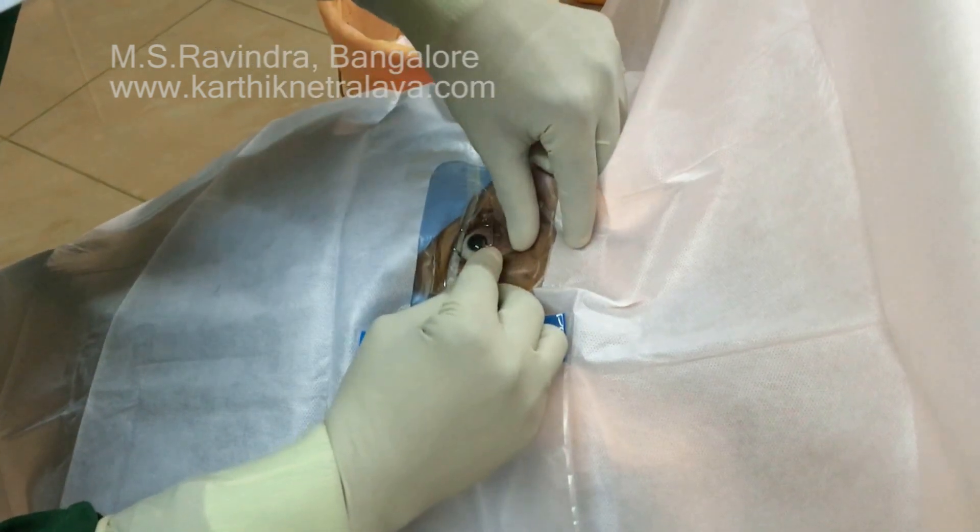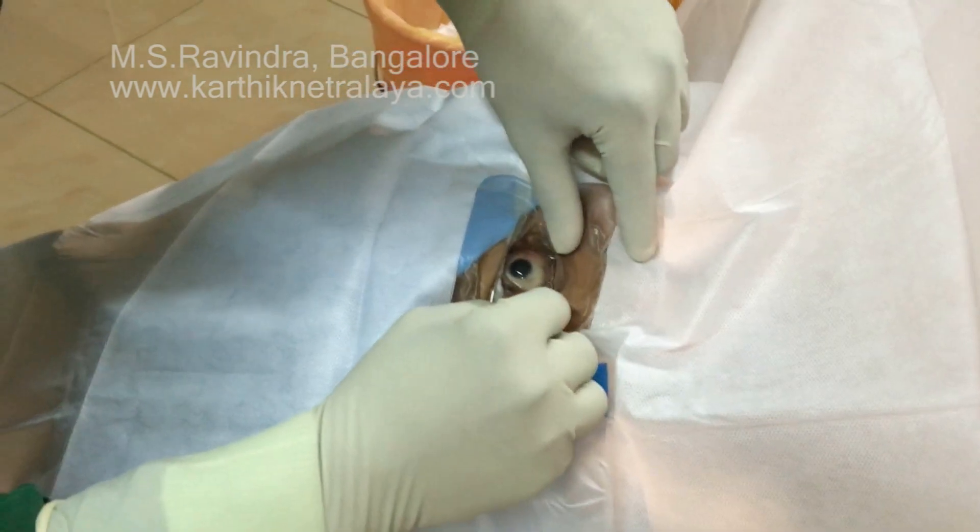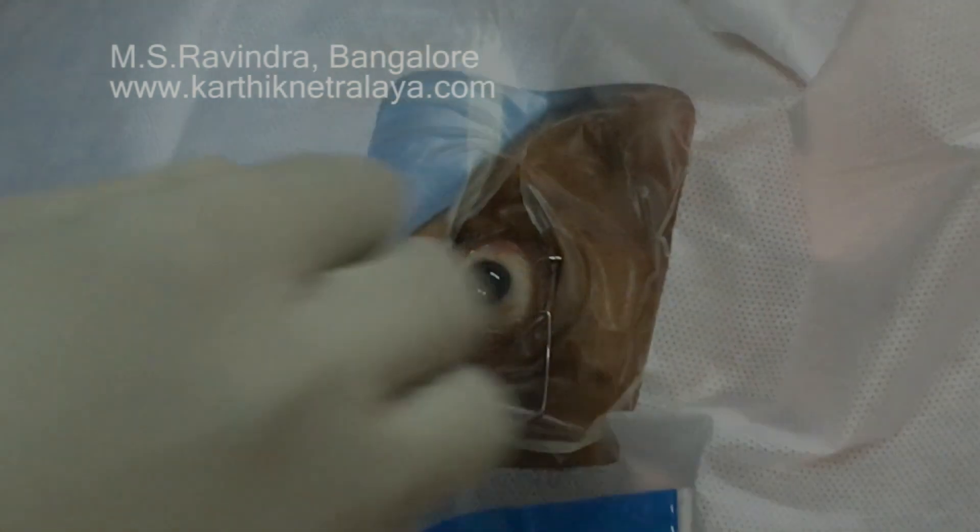He places the speculum and the lashes are totally secluded — this is a very comfortable area in which to perform surgery.